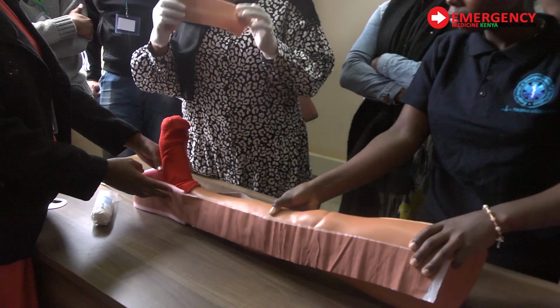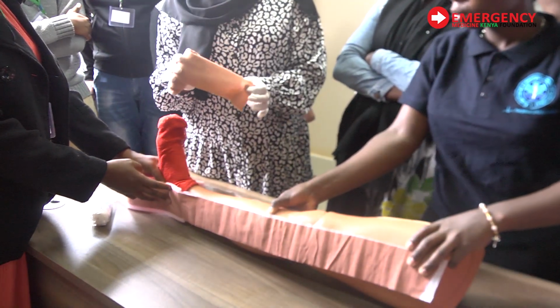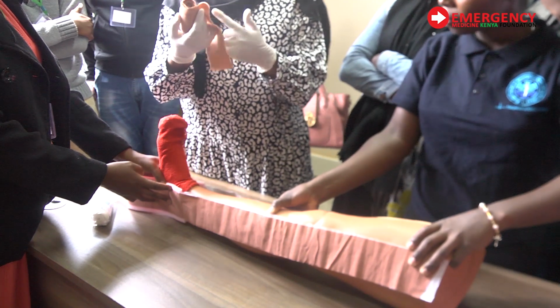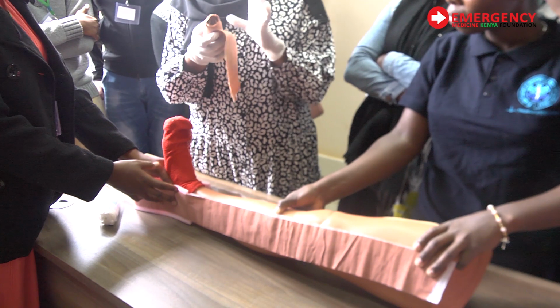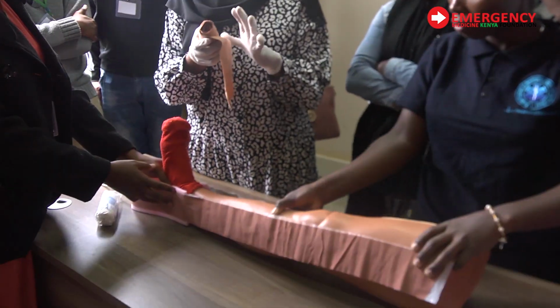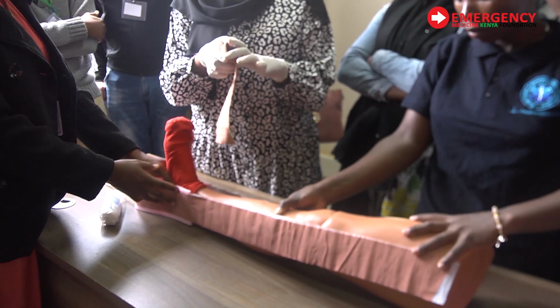So what do I do? There are different methods. Some people go above, some people go down. Regardless of how you do it, it has to cross above each other 50%, okay? And the other thing is make sure you have not tightened the leg so much that you get compartment syndrome. That's the most dangerous thing you can do for the patient, okay?